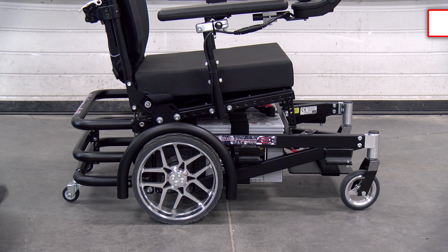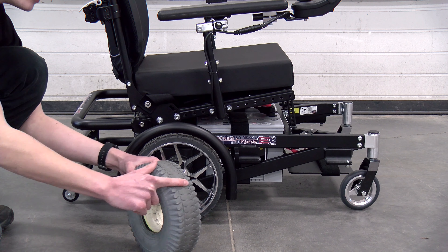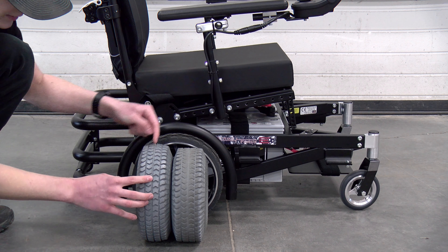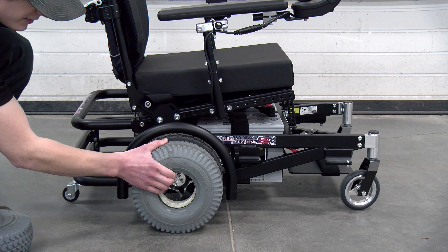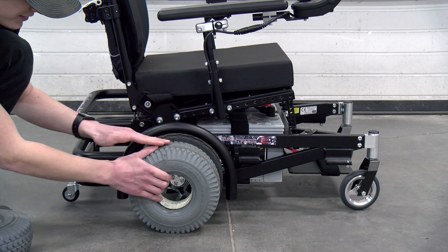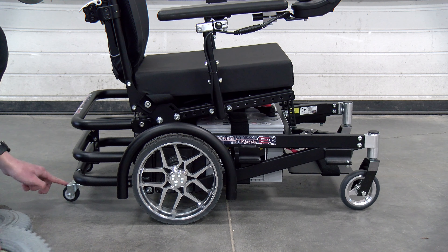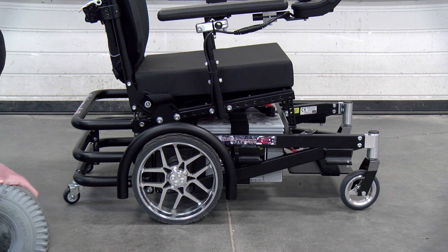One last thing I wanted to mention that can also affect the rear casters is tire wear. I have a very worn out tire here comparing it to a brand new one, and you can see how much taller the new tire is compared to the old one. So as your tires wear out, the chair will actually sit lower to the ground. This is something to keep in mind when changing your tires or going over your chair before a big tournament — you may need to add or take out some washers.